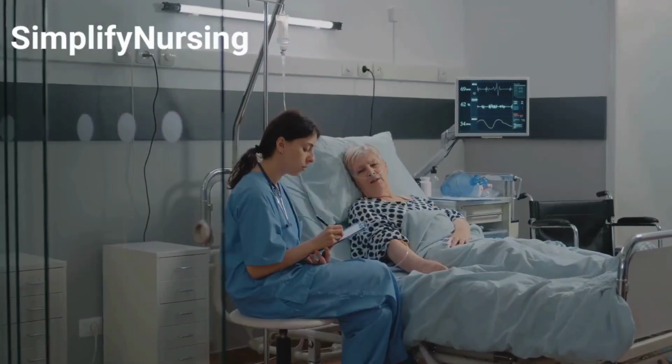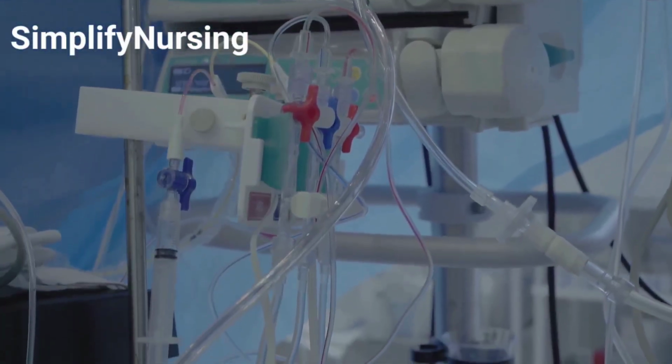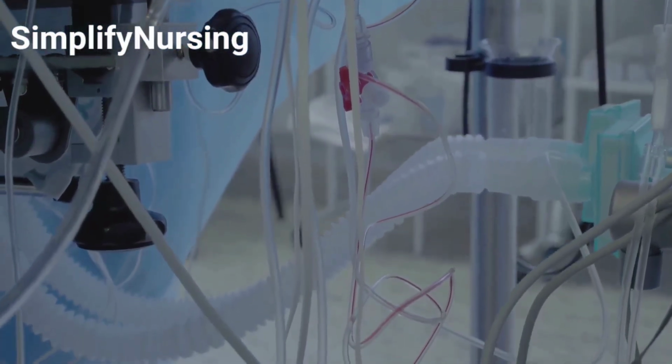Preparation is key. First, obtain informed consent. Make sure all sterile equipment is available. Then position the patient appropriately, usually sitting upright or at a 30 to 60 degree angle.